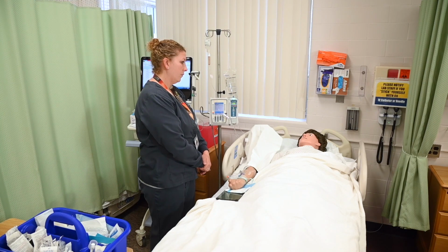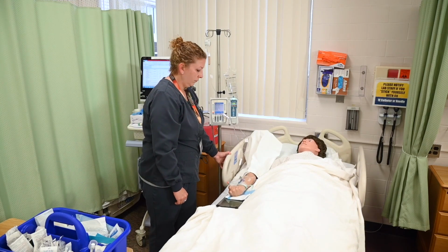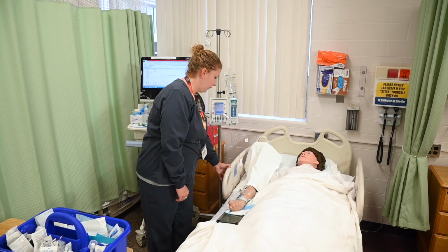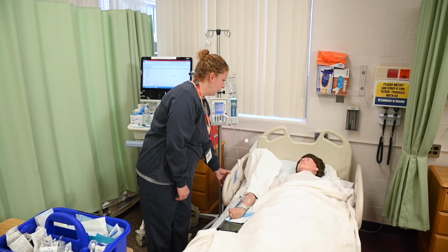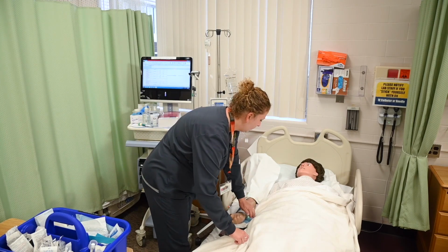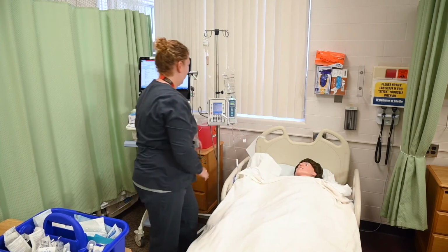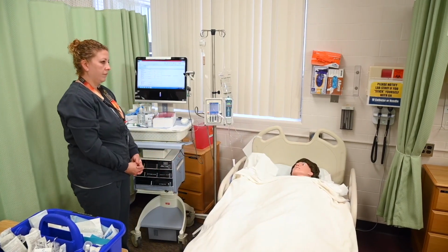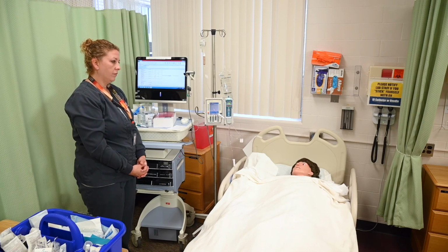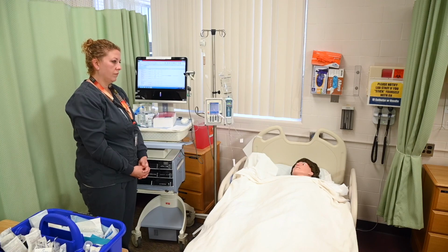Help the patient into a comfortable position and place toiletries and personal items within reach. Place the call light within easy reach and make sure the patient knows how to use it to summon assistance. To ensure patient safety, raise the appropriate number of side rails and lower the bed to the lowest position. Remove gloves and perform hand hygiene, which I've already done. And Sarah has maintained professional demeanor and language and safety throughout the procedure, so the procedure is complete.